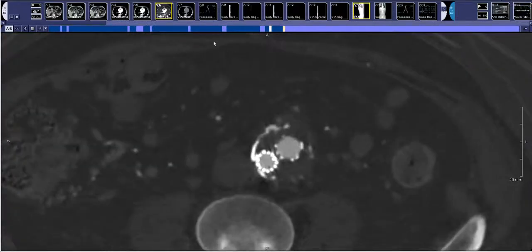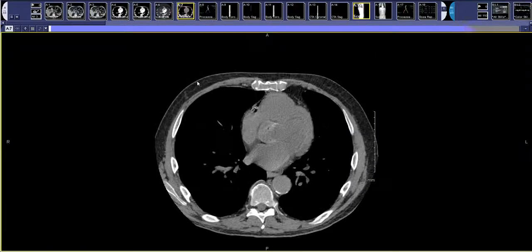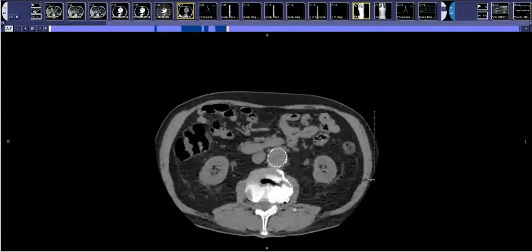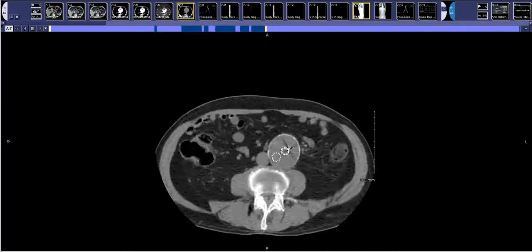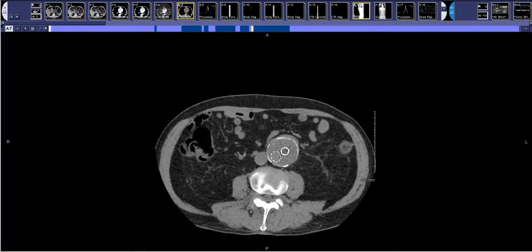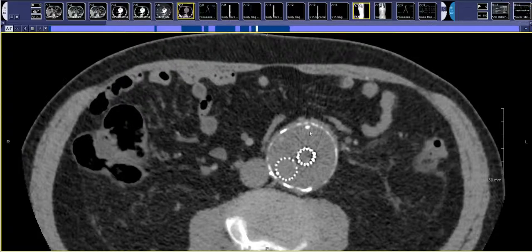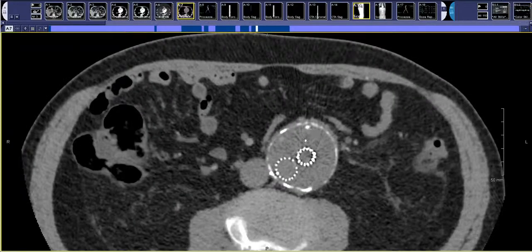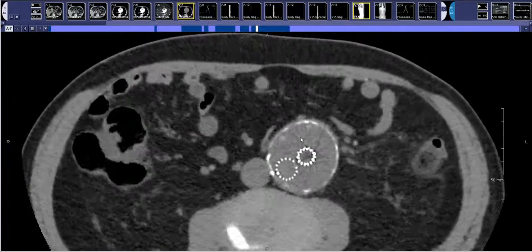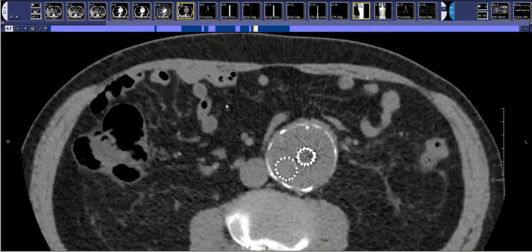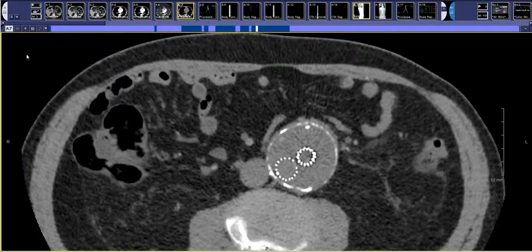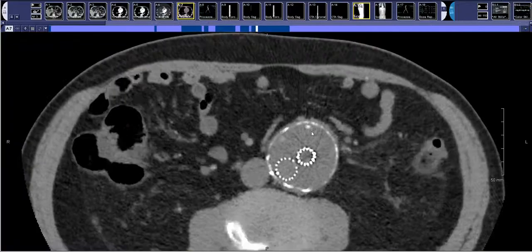The last thing you get with a dual energy scan is a virtual unenhanced image. If this had been protocoled incorrectly and the original non-contrast series was omitted, you can bring up this virtual non-contrast and see that a small focal high attenuation area is a calcification — because it was not subtracted away when the dual energy technique made the virtual unenhanced image. It's not quite ready to totally replace a non-contrast scan, although it can be helpful especially when a non-contrast scan was not done as part of the protocol.